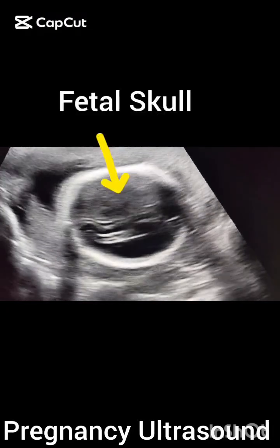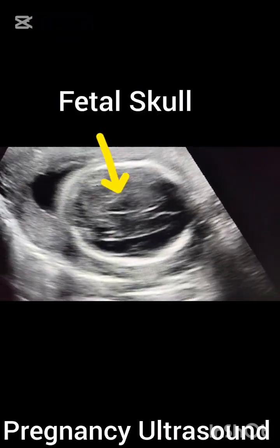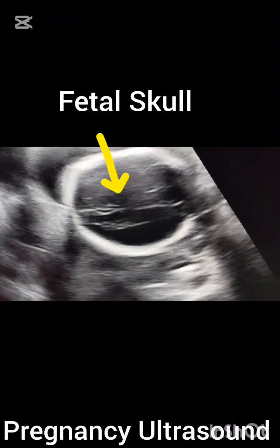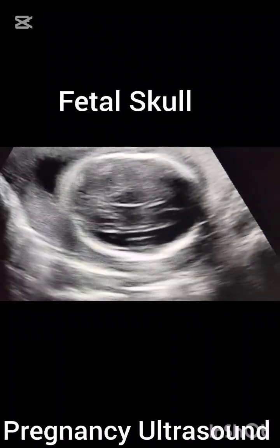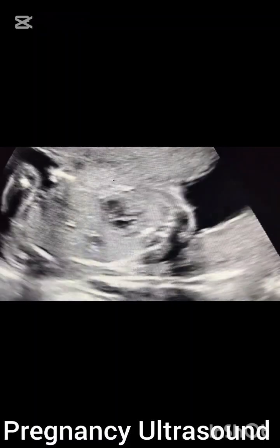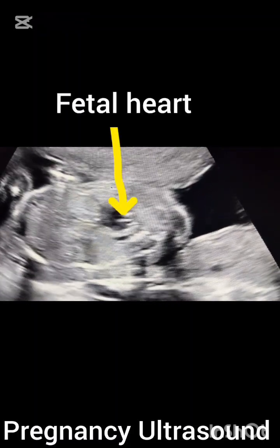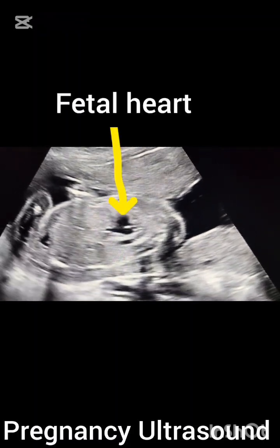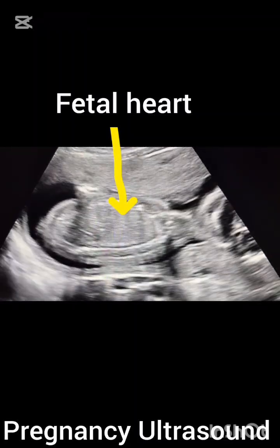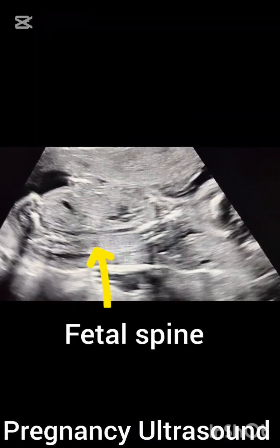Today in this pregnancy ultrasound video, you can see this is a fetal skull — the biparietal diameter, the first parameter in fetal biometry. This is fetal cardiac activity; you can see clearly the four-chamber normal heart with activity present.